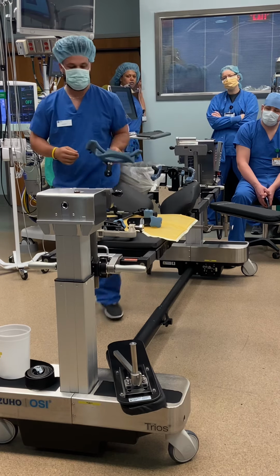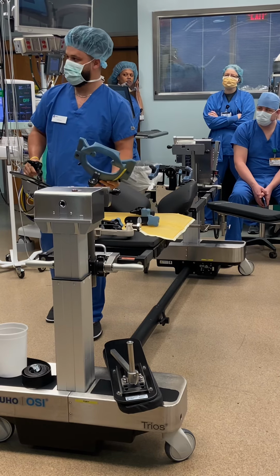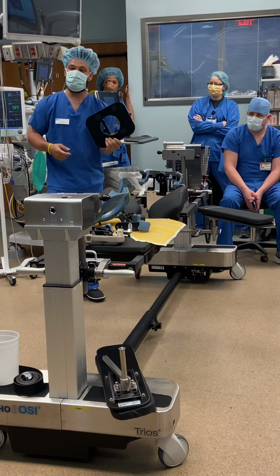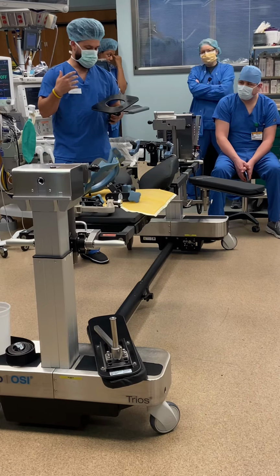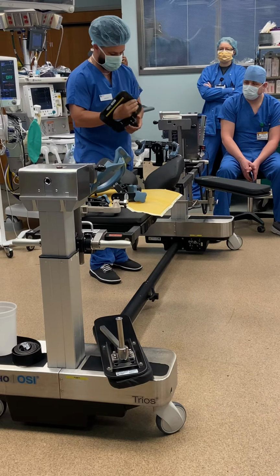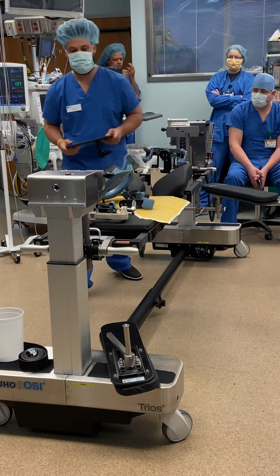Is there a disposable pad that goes on that? The prone view pads, we stock them in anesthesia. Okay, the big white cones. The second one does come with multiple pads. If you're having a face, you can also put a donut here. It's like a little T-shape cut out. Same thing though. Put it in here, screw it in, pinch the bottom to release it the same way.